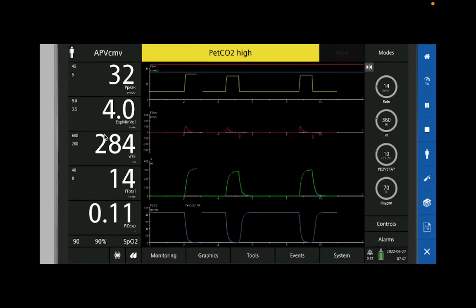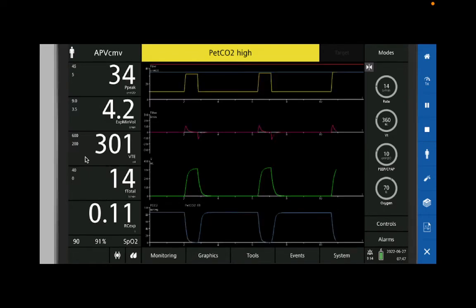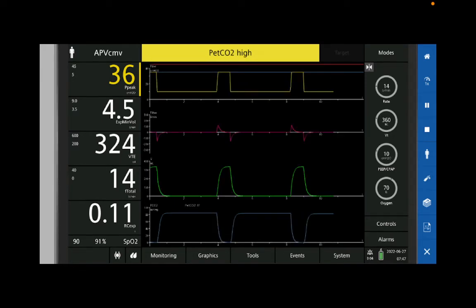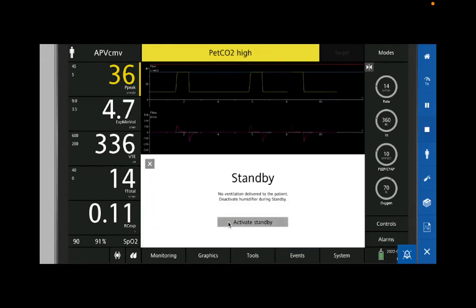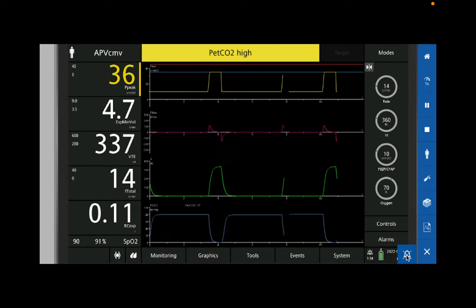So, but are we reaching 360? What do we do? So part of the ventilator card says if your plateau pressure is above 30, you can do what to the tidal volume?